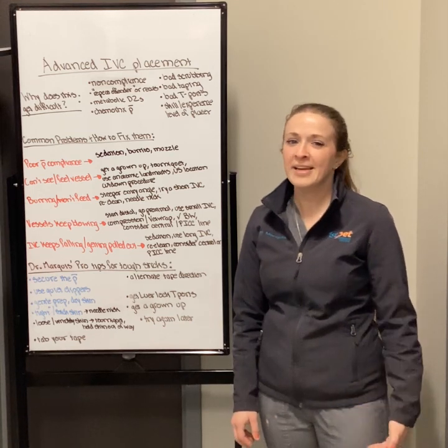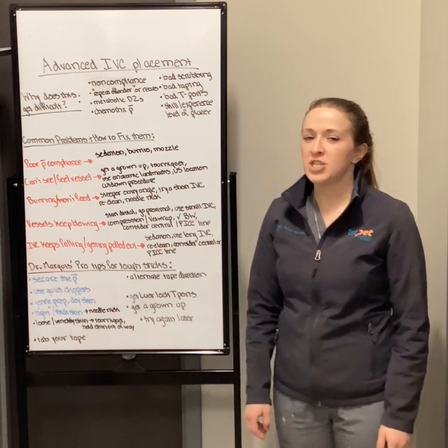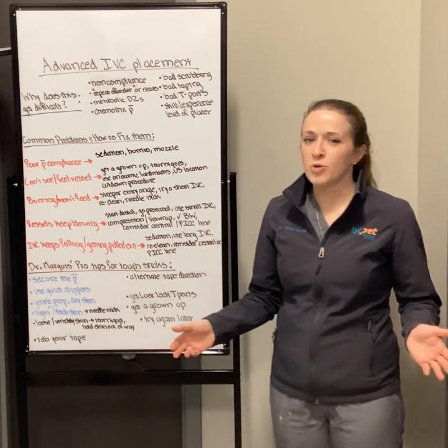I'm Charlotte Marqui. I'm a board-certified veterinary anesthesiologist, and today I will be talking to you about advanced IV catheter placement and IV catheter troubleshooting.